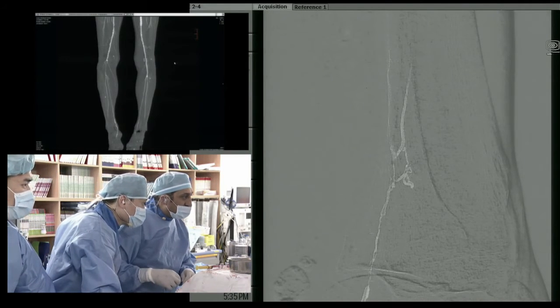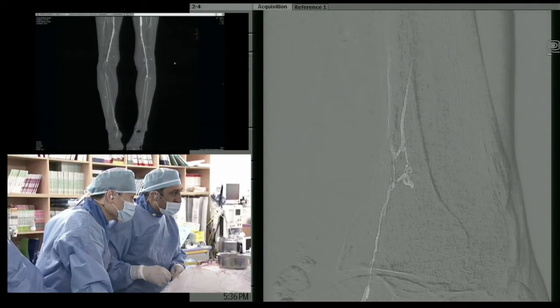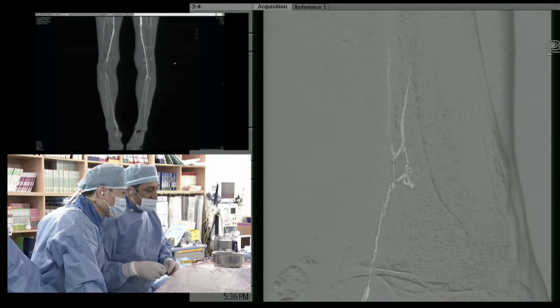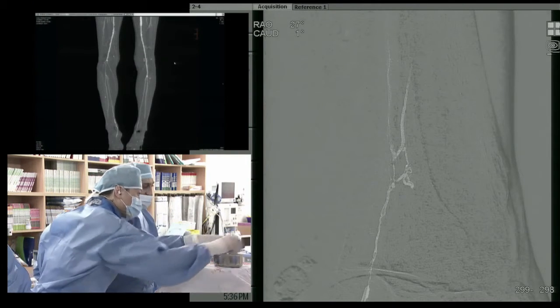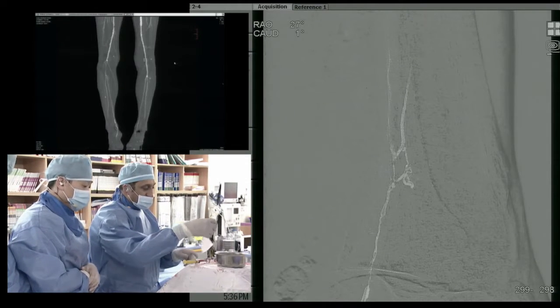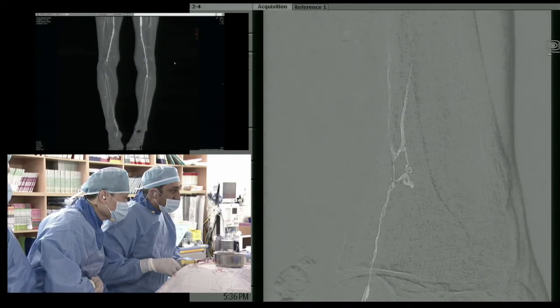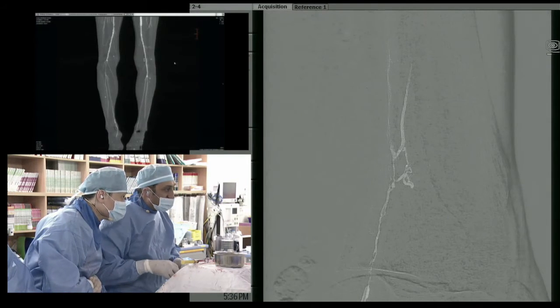In the old coronary days, they used to make a Terumo Gold. Yeah, it had that little bulbous tip on the front end, and it used to follow a lumen pretty nicely. They stopped making that. Can't see it. Yeah, this is very similar to that, and can make you look really good at times, but I'm not sure this is going to be one of those times. Okay. There it is, right there.